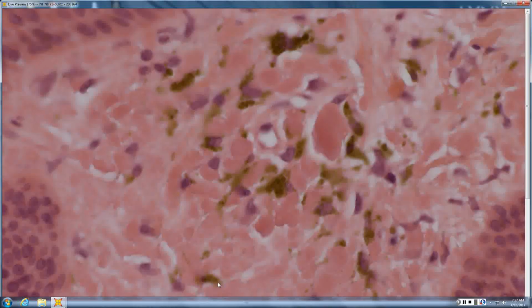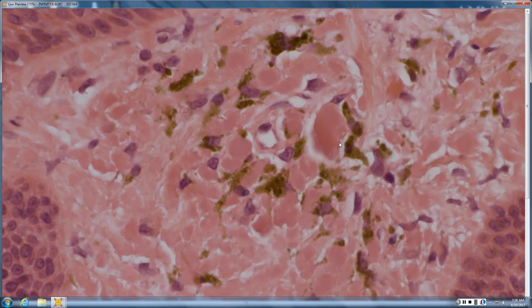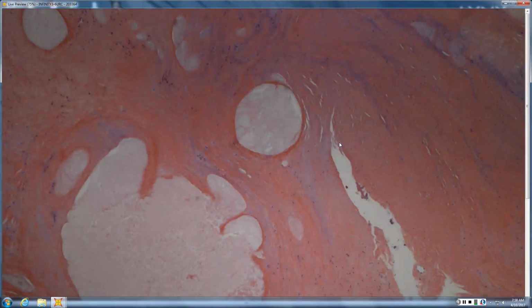So what would that be? That's probably some macular amyloid. When it's surrounded by pigment, it's epidermally derived. That can be macular amyloid, it can be lichen amyloid, or it can be neoplasm-associated amyloid. What do you think it is in this case? Probably the keratinocyte, and probably just because of the seb. You see it under sebs, under Bowens, under basal cells, all kinds of things where you can have neoplasm-associated amyloid. The big thing is it does not mean systemic amyloidosis.